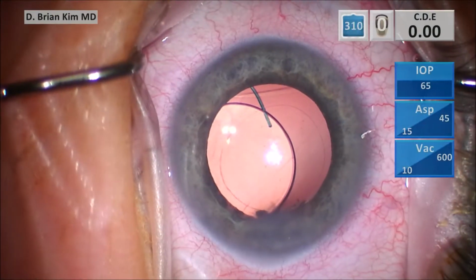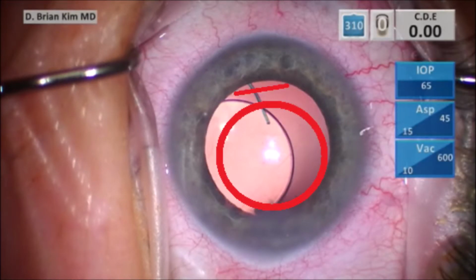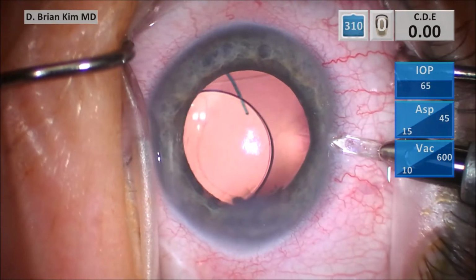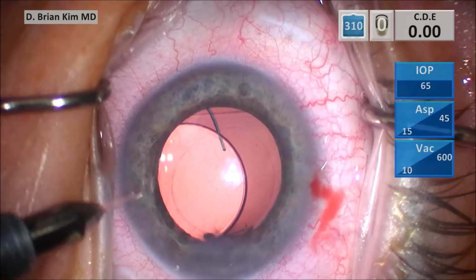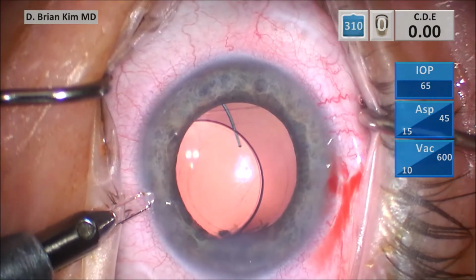So you can see the lens is dislocated, and you can see the anterior capsule opening there. And right there is an area of zonular dehiscence or weakness that you can see. You can see the anterior capsule opening is a little bit decentered. And so I'm a little bit mindful of this. And I wonder if, during the exchange, the capsular bag was a little bit stubborn and attached to the lens, and it caused that small area of zonular weakness.